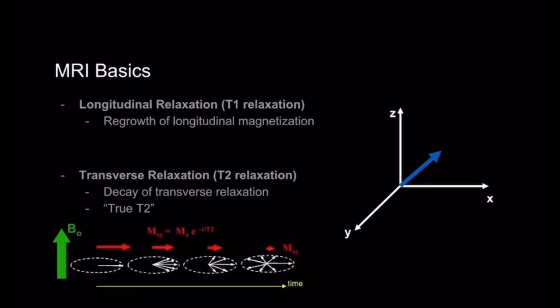In this diagram we have here, we have the Z-axis pointing upwards, and that's again the magnetic field direction. And over here we have the XY plane that's flat. And early on we have a single line here that represents all of the precessing molecules in sync. And the red line here is the net magnetization vector that shows full signal at the beginning here.